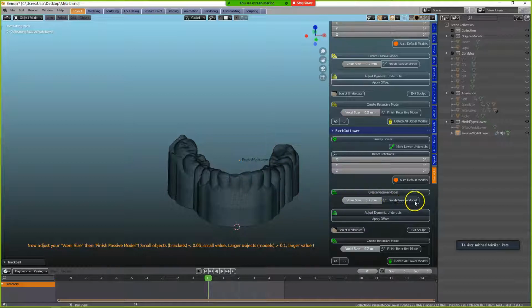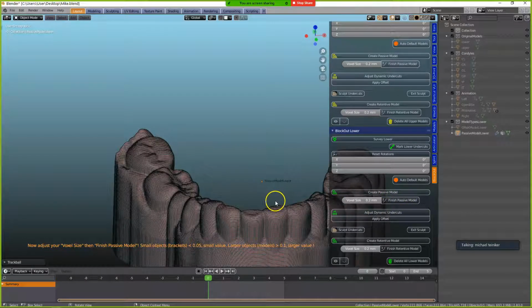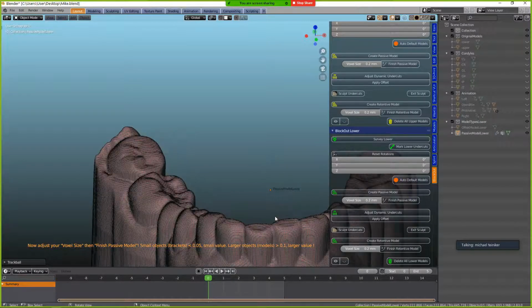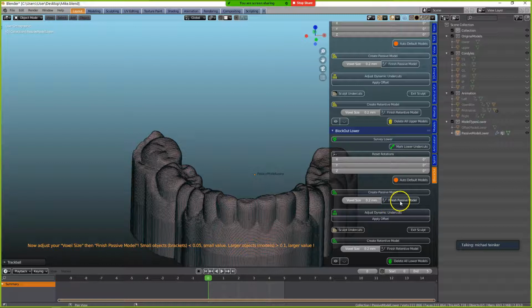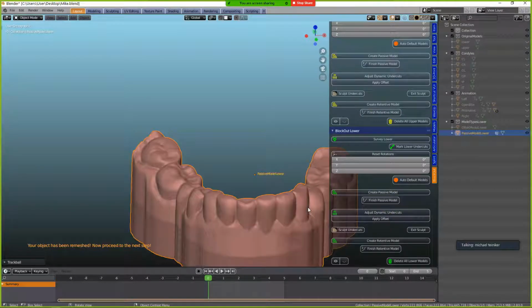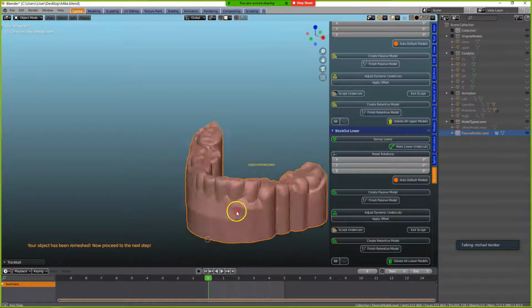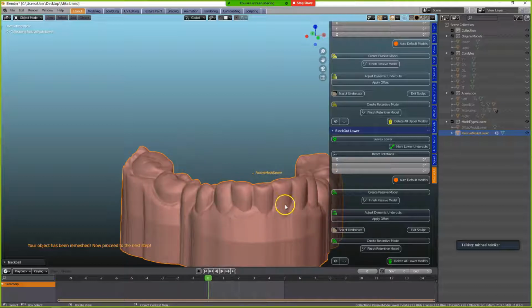Okay, so we are here and we can set the vox. This is auto, and it's a few more steps, and some people say, but why can't you do a default and run through it? But this is what the auto default button is for. And later in crown and bridge work, you'll see we have to remesh this at very, very fine. So this is the model that we use for implant guides.